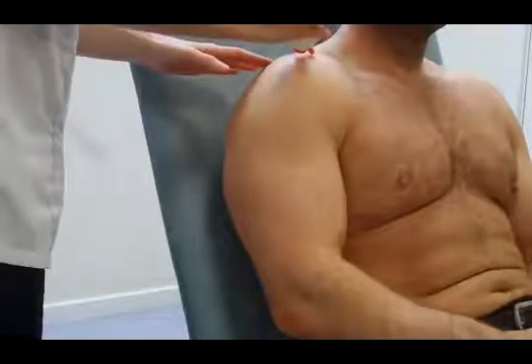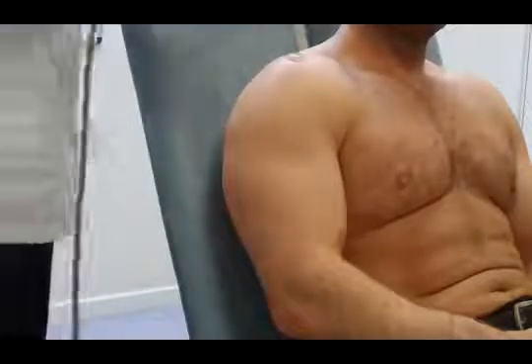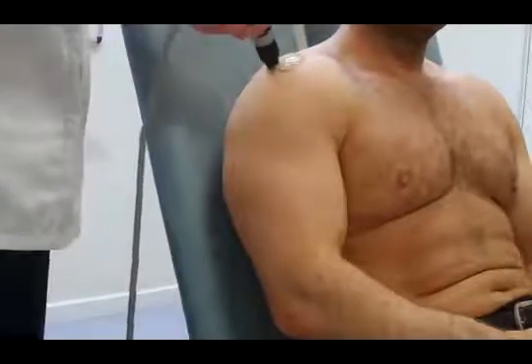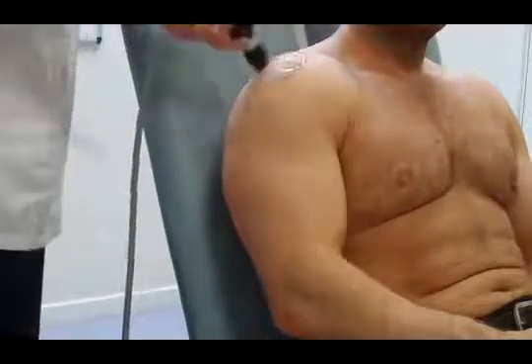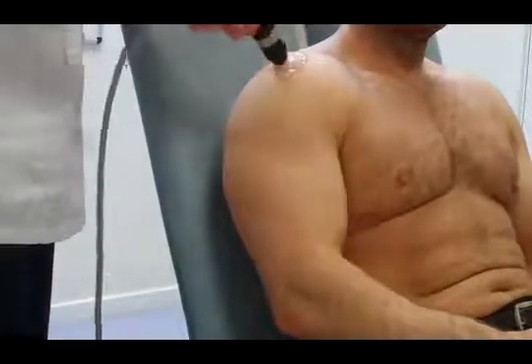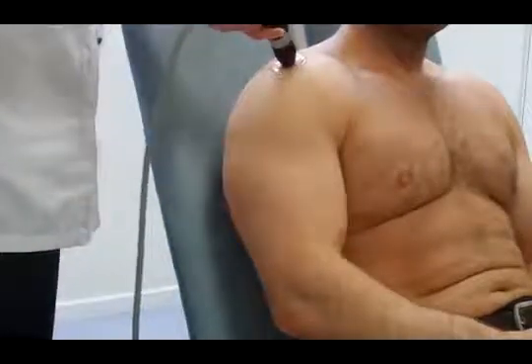And we're coming to 14 Hz, as the shoulder tends to be a lot more sensitive than other parts of the body, and faster treatment rates are actually easier to tolerate. We just bring the gel around the head and around the shoulder, and then start the treatment.